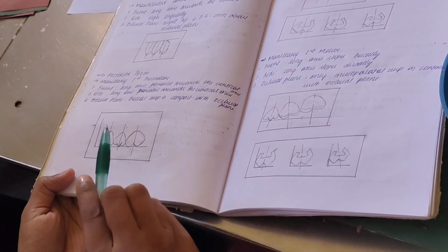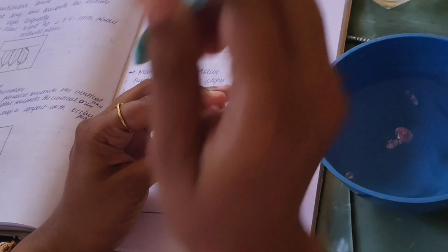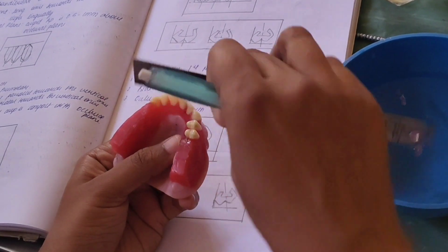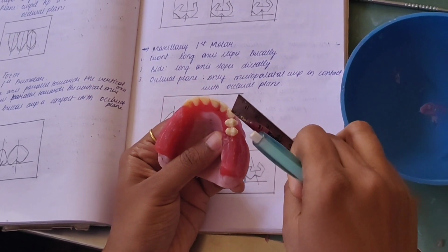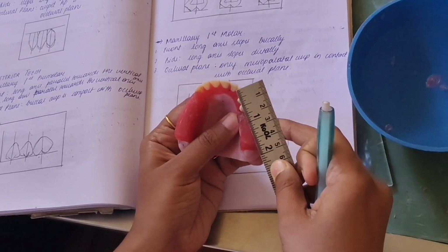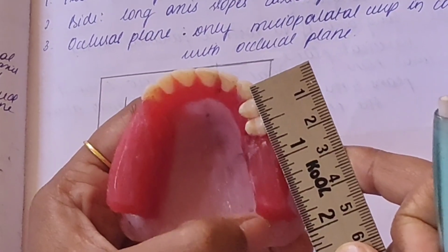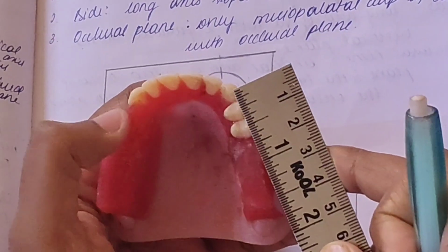Okay, I'm talking about premolars. Buccally when I see, this is straight, both the premolars. Okay. Then when I put the scale from here on this part of canine, the first half of canine is with the anterior, the second half is rotating towards the posterior. So there when I put the scale, it should be in one line, rotating in that one line towards the ridge, okay? It will come over the ridge automatically if you follow this scale line.